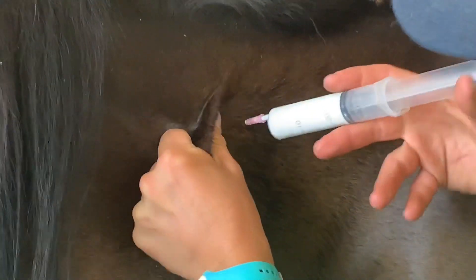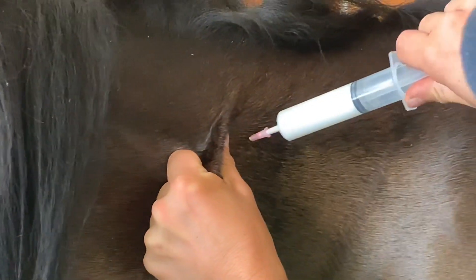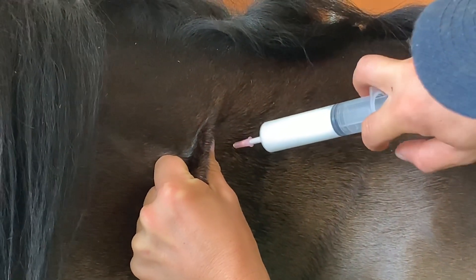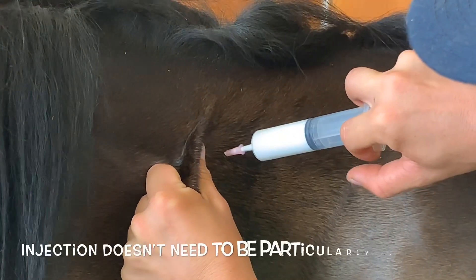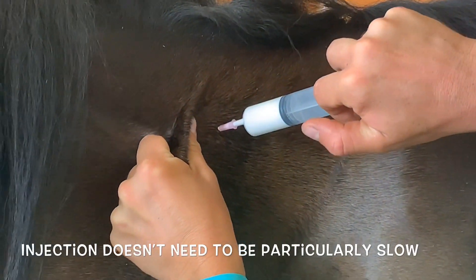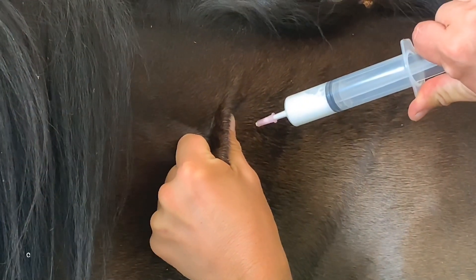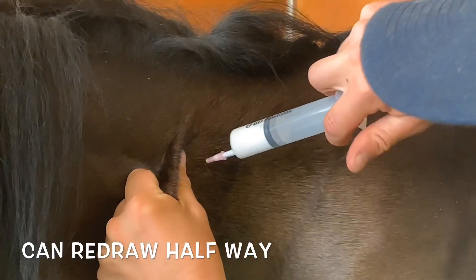Now she's not noticing because I've got a good skin twitch. So again, we're going to draw back — beautiful, no blood. Now we're going to push it in. You don't have to do this particularly slowly so she can feel it a little. Halfway, I tend to like to check again — no blood — and keep pushing.